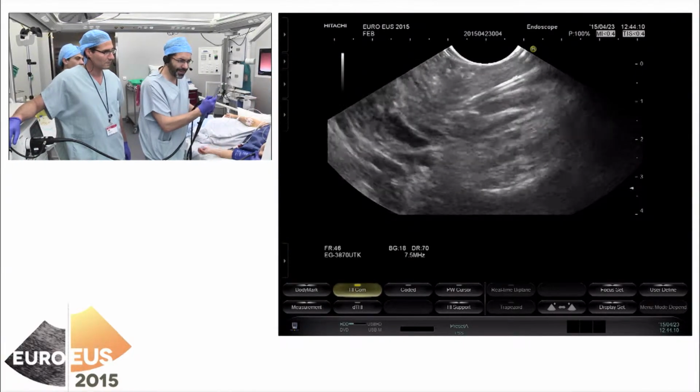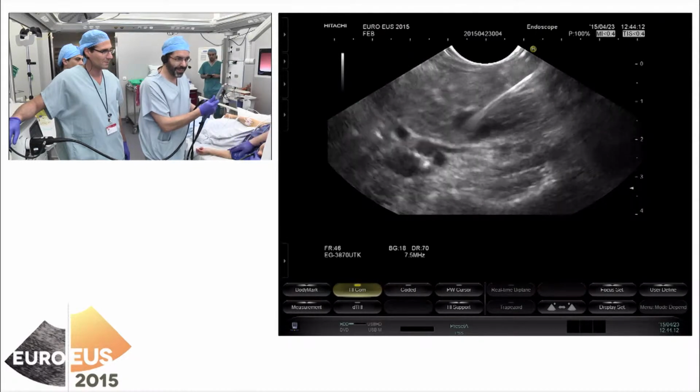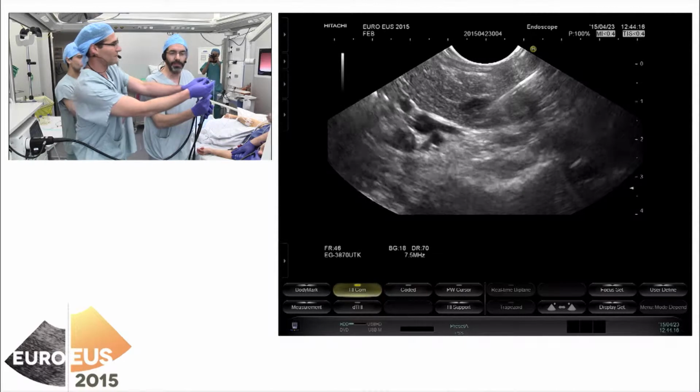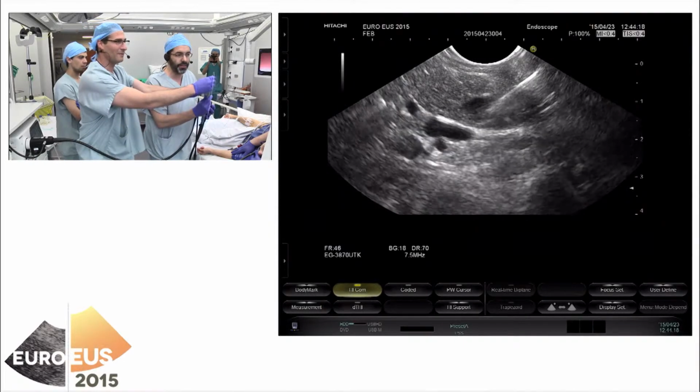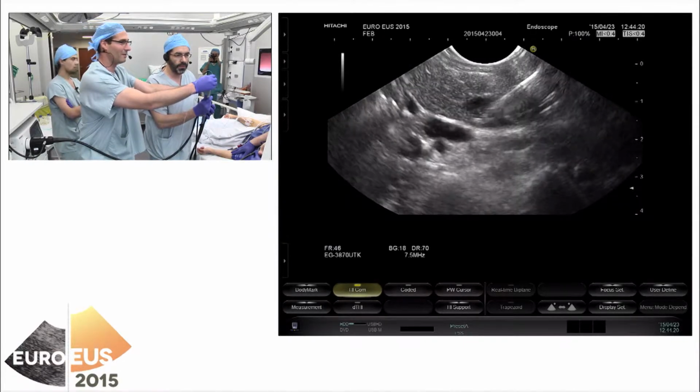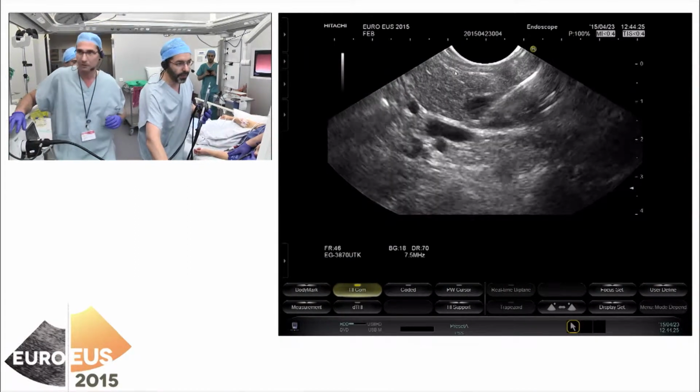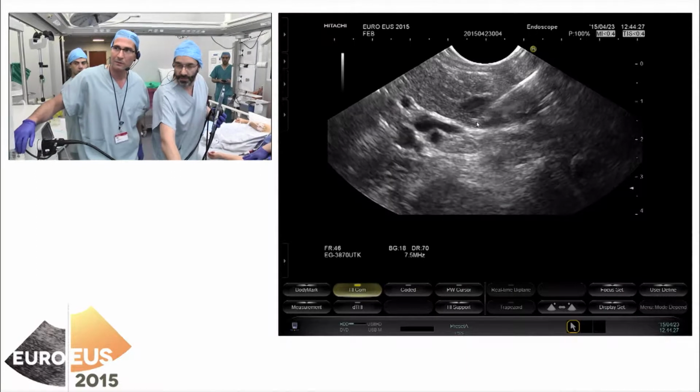Yes, okay, you're in. We are inside of the lesion, and now I need the help of Fabrice to show you exactly how this works. You can see in the probe, EUS is imaging the tip of the Cellvizio probe. I think this is the tip.